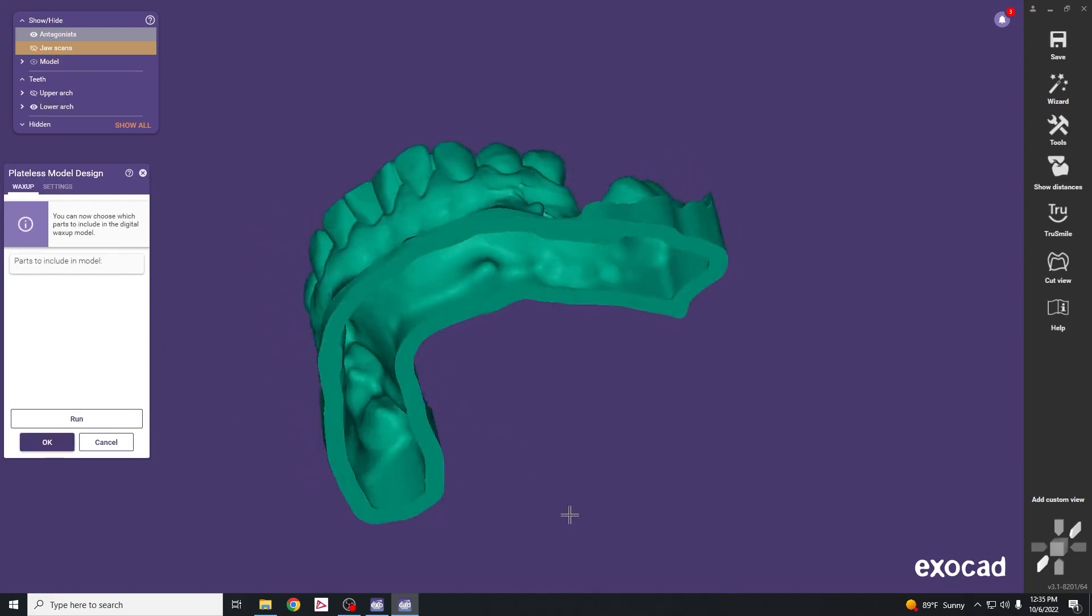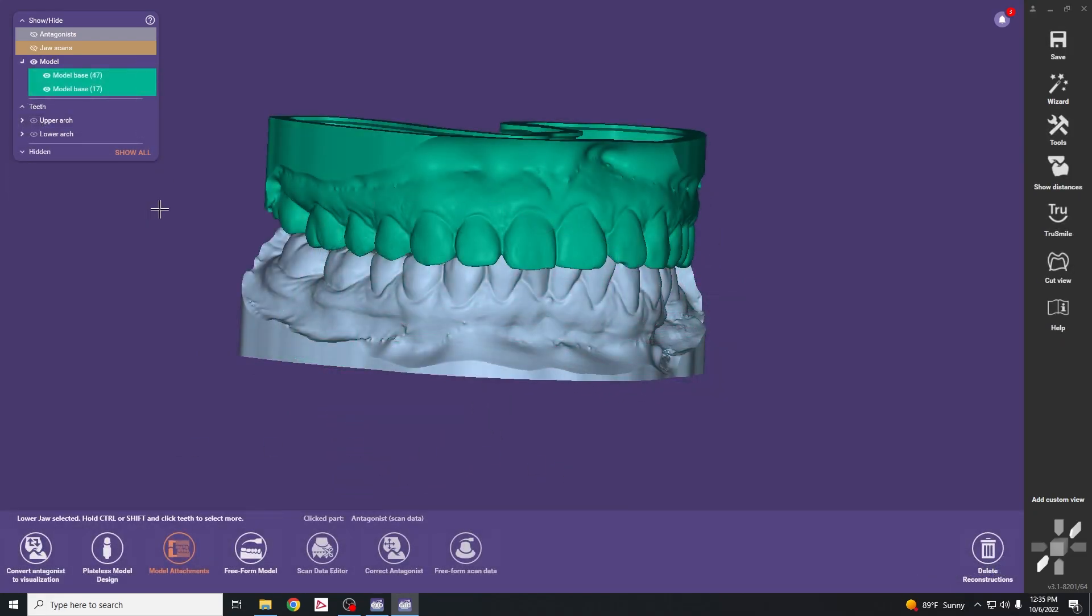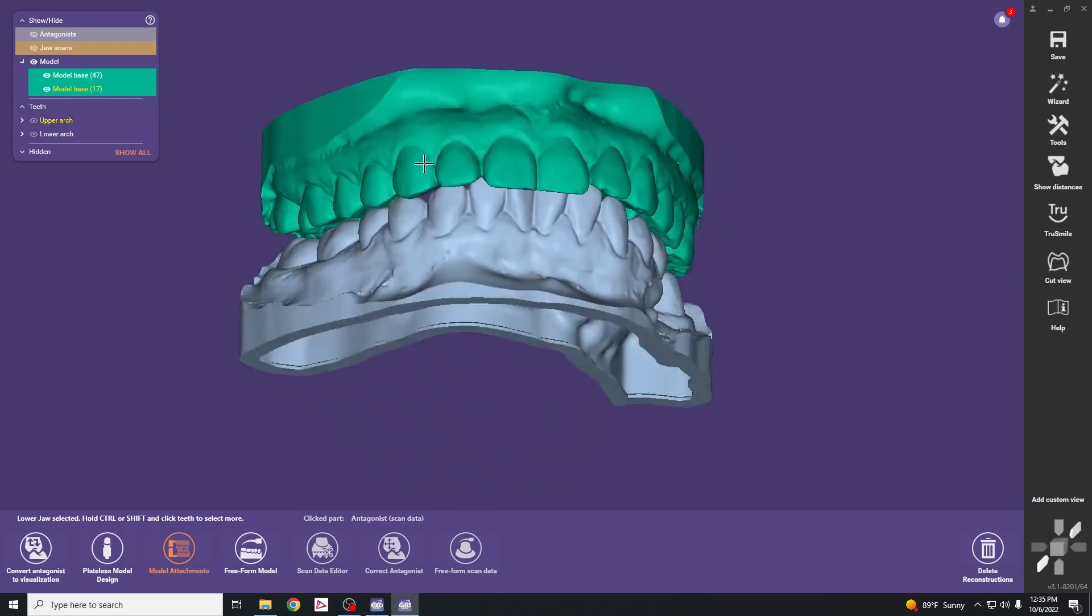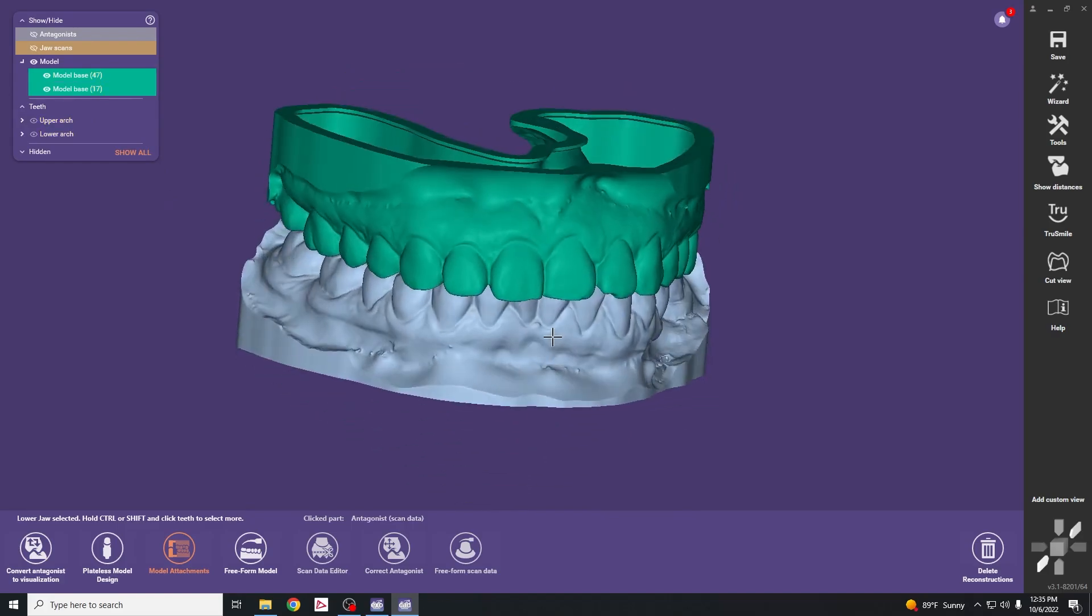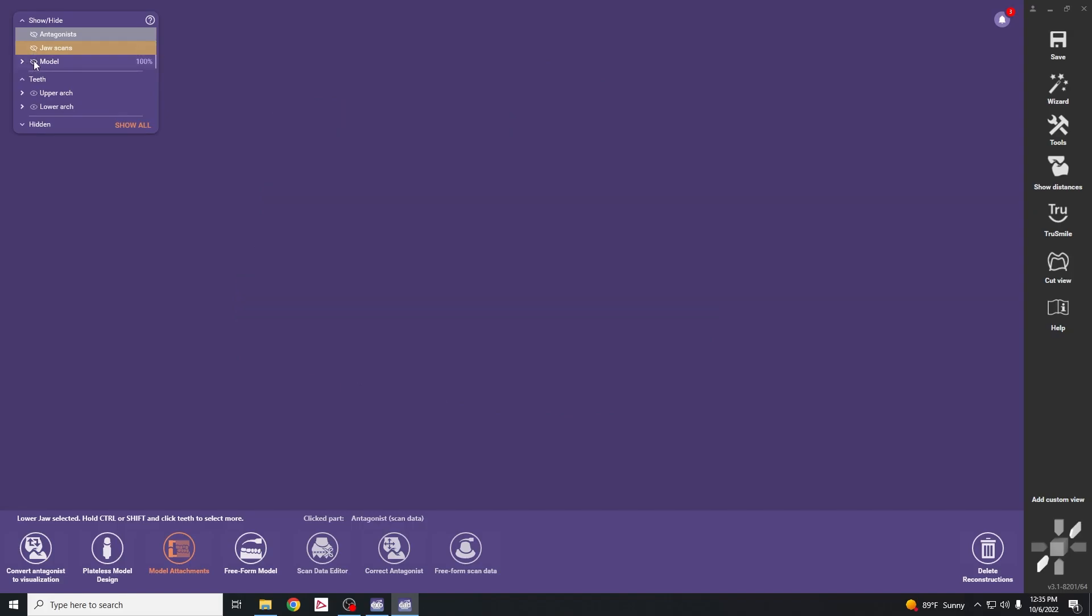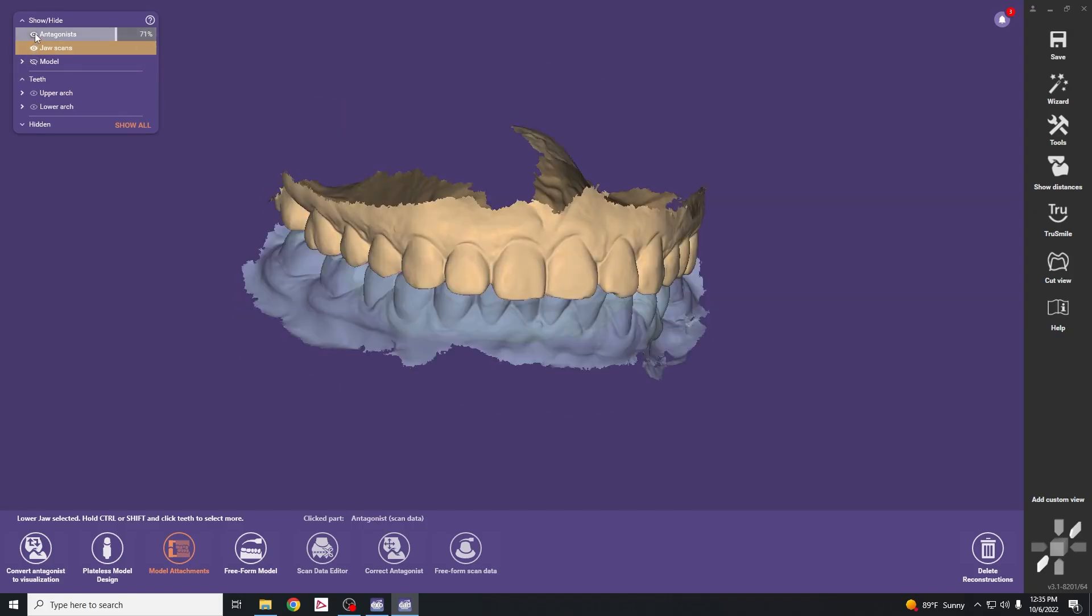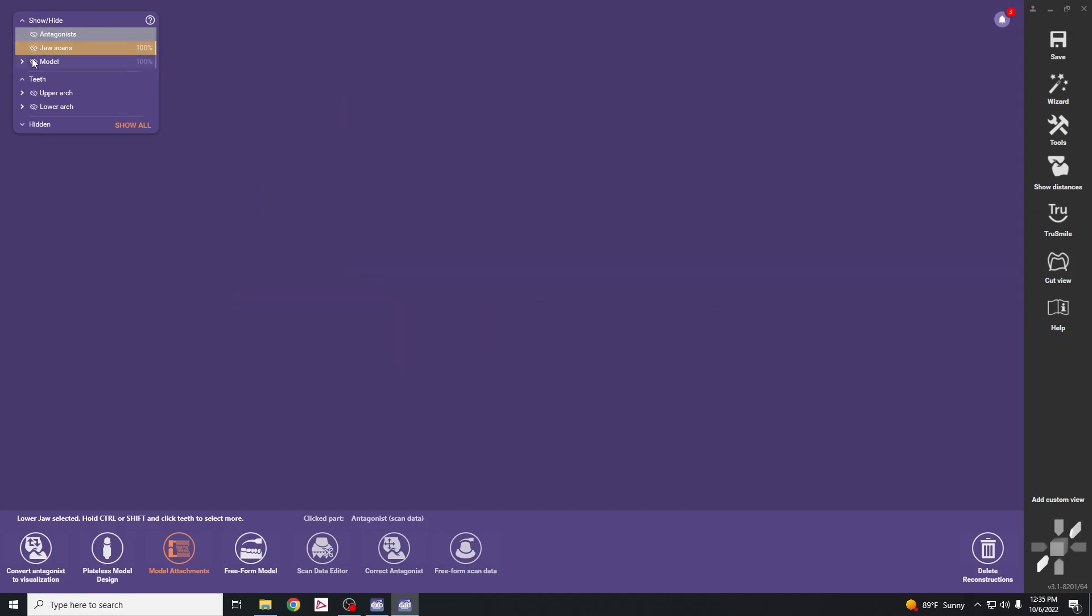The lower is now completed, then hit OK. You can see the models for the upper and lower highlighted under this bar, and if we turn that off you can see the original scans that were imported.